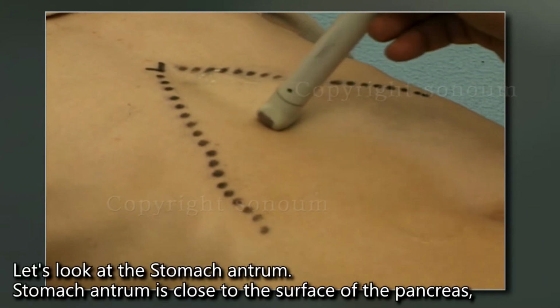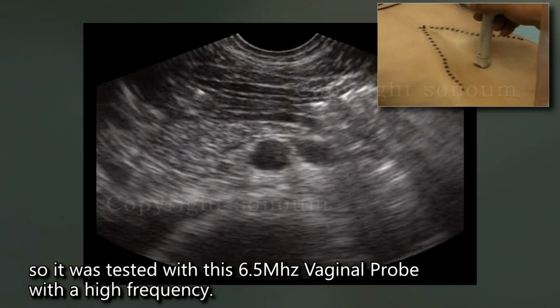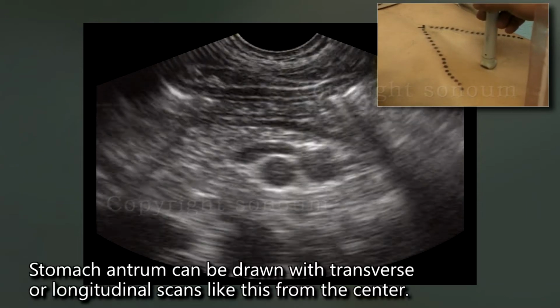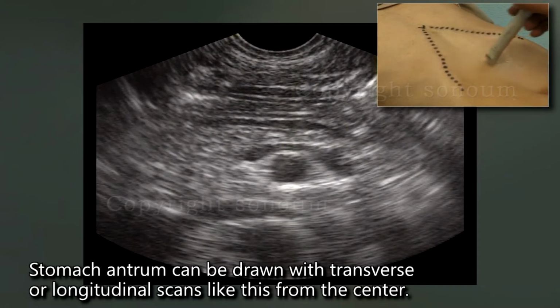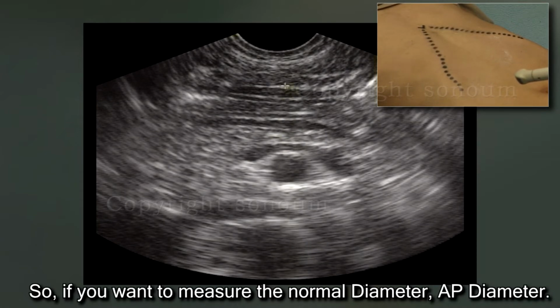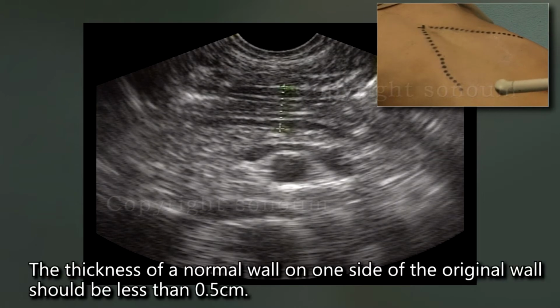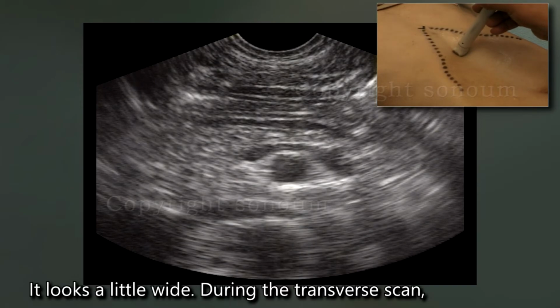Let's look at the stomach antrum. The stomach antrum is close to the surface, so it was tested with this 6.5 MHz vaginal probe, with a high frequency. The stomach antrum can be drawn with transverse or longitudinal scans, like this from the center. What I'm looking at right now is the stomach antrum. From here to here, the anterior and posterior walls of the stomach are attached. So, if you want to measure the normal AP diameter, it is now 1.2 centimeters. The thickness of a normal wall on one side should be less than 5 millimeters. But now, because there is a little content, it looks a little wide.